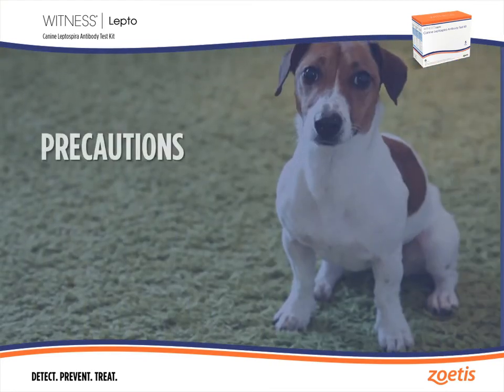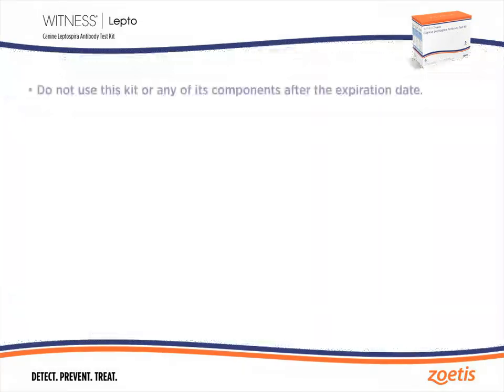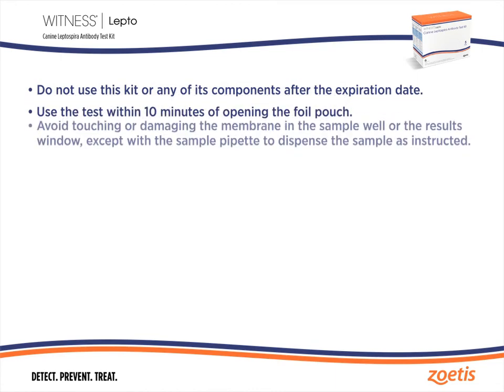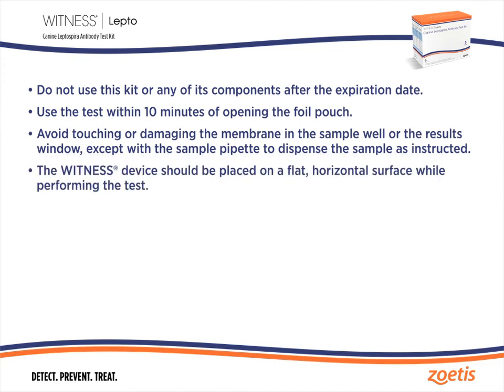A few precautions to remember before performing this test. Do not use this kit or any of its components after the expiration date. Use the test within 10 minutes of opening the pouch. Avoid touching or damaging the membrane in the sample well or the results window except with the sample pipette to dispense the sample as instructed. The witness device should be placed on a flat horizontal surface while performing the test.